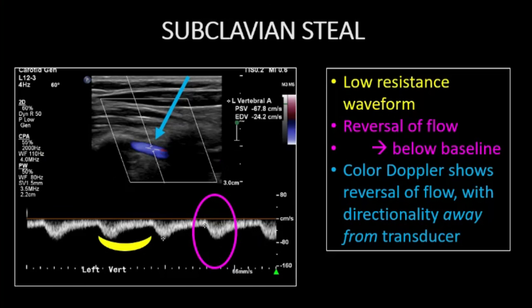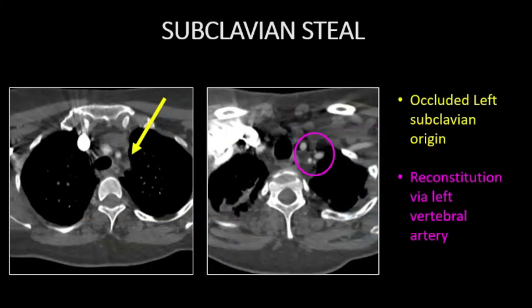In subclavian disease progression, the vertebral artery tracing makes a definitive change to complete flow reversal. The waveform remains low resistance, but the direction of flow is away from the transducer on the color doppler image, reflecting caudally directed flow to supply the subclavian artery distal to stenosis. This spectral doppler displays a low resistance pattern below the baseline. CT angiography confirms the left subclavian artery occlusion at the origin with reconstitution by the left vertebral artery.